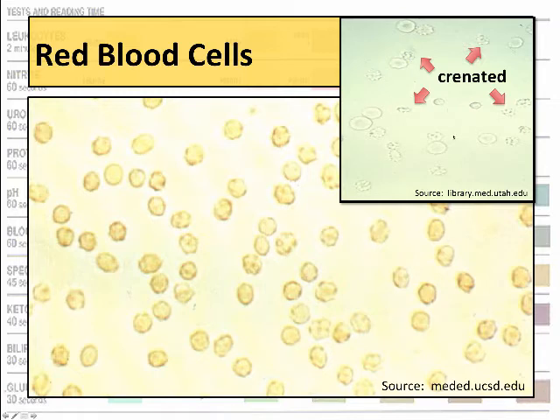On the other hand, we don't have any images of them here, but you might see one that looks very faint. It looks as though there's not much in it at all. You can just see the outline of the membrane, and that's because the red cell has most likely burst. It was in a very dilute, very hypotonic urine specimen, and that has caused water to rush into it, burst the cell, and leave just the membrane behind. That's called a ghost cell, but it's still a red blood cell, and it's something you might want to note.